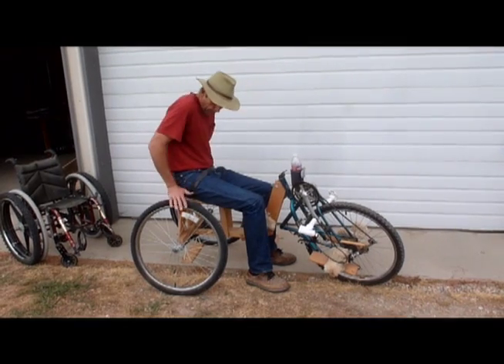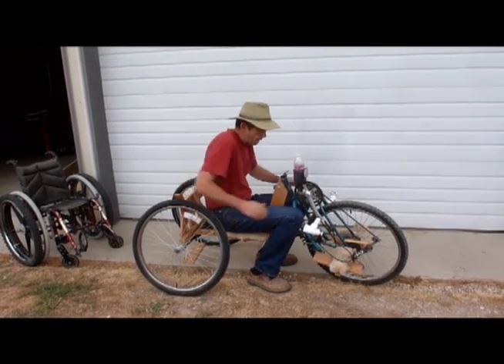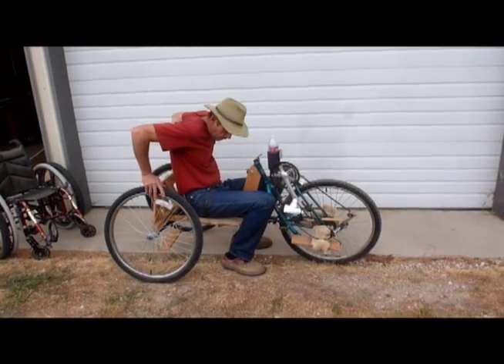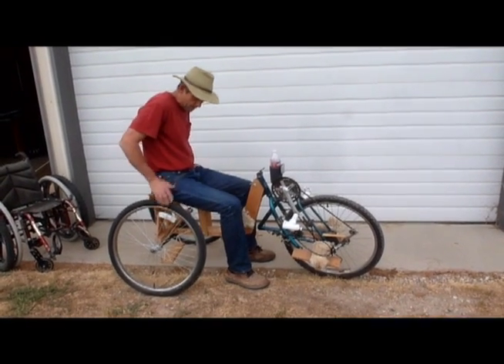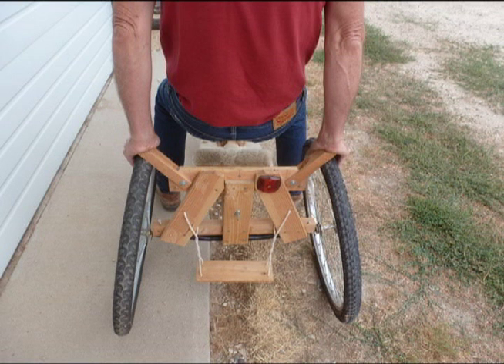The seatbelt allows you to lower the hinged seating system to the riding position, secure your core while riding, and then raise back up again. The front brake is applied from the hand crank and the locking rear brakes engage when you press on the arm supports.